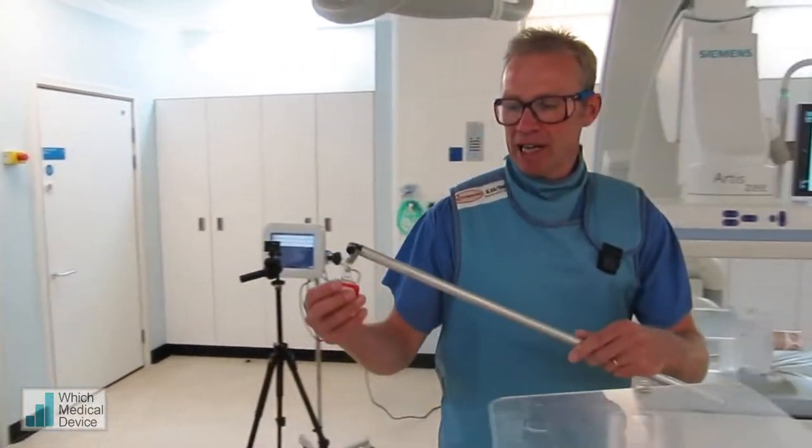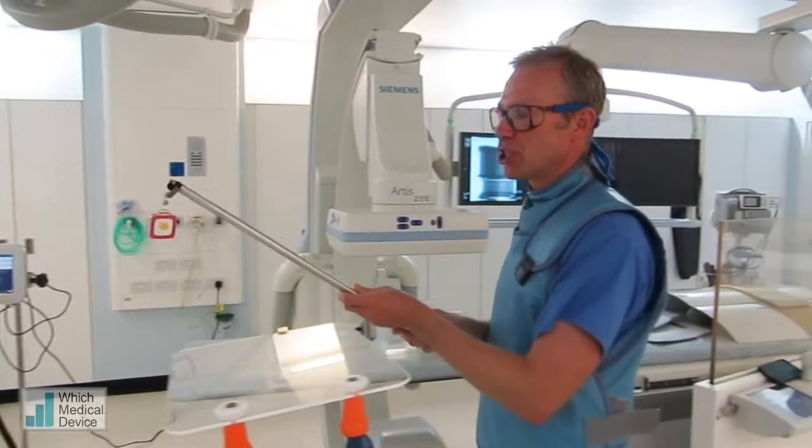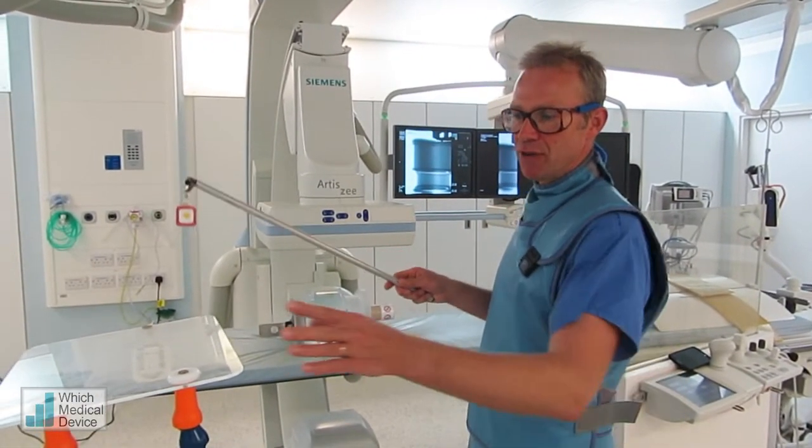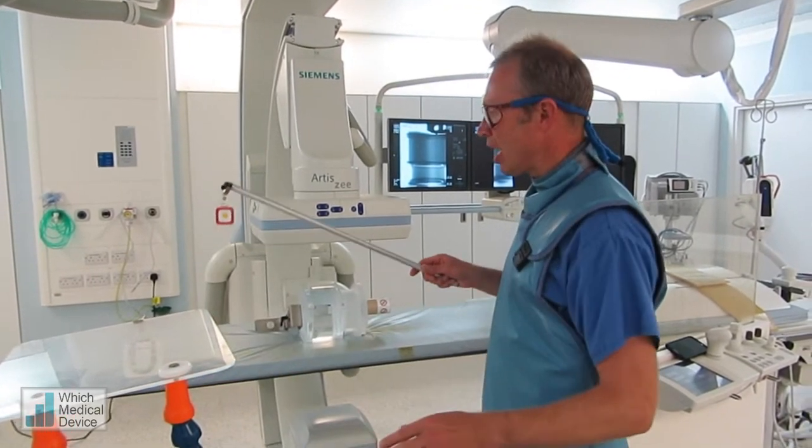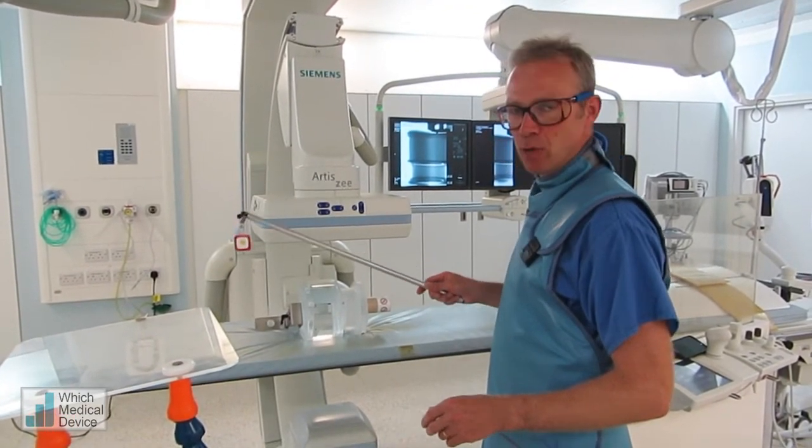I've connected one of the badges onto this pole, and I'm going to be positioning this in various places around the image intensifier. And we've got another badge here which is in a fixed position. I'd just like to show you what happens to the dose depending on where you're standing.